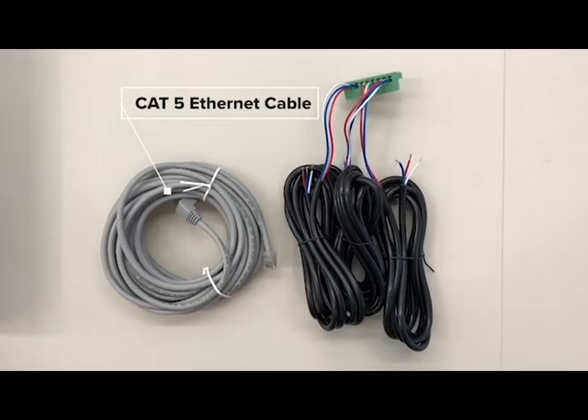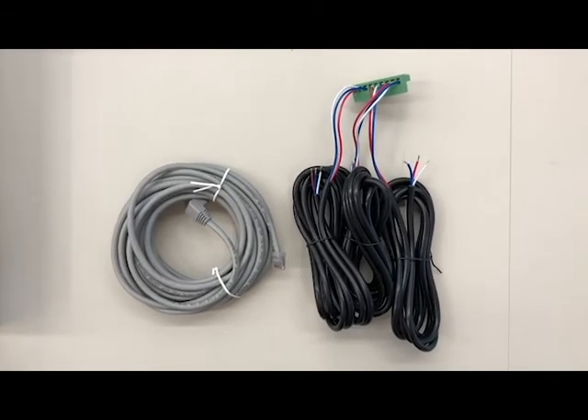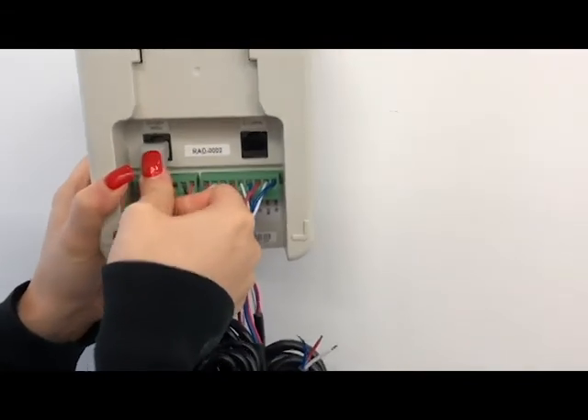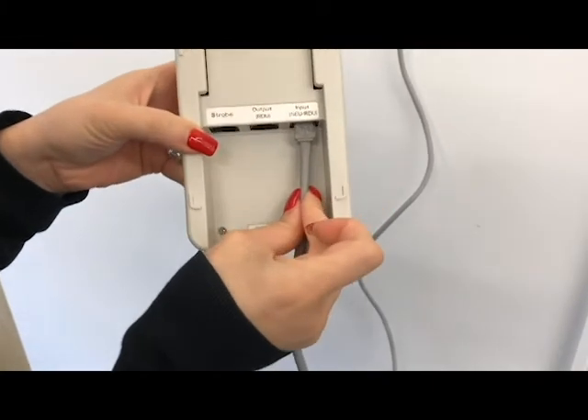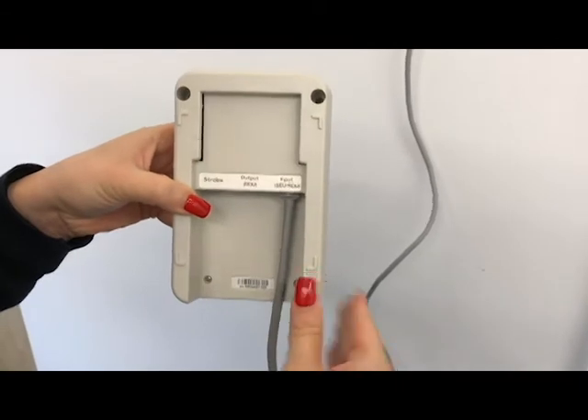Locate the CAT5 cable and route it between the main sensor unit and the remote display. Plug the cable into the output port on the back of the main sensing unit. Then plug the other end of the cable into the input port on the back of the remote display unit.